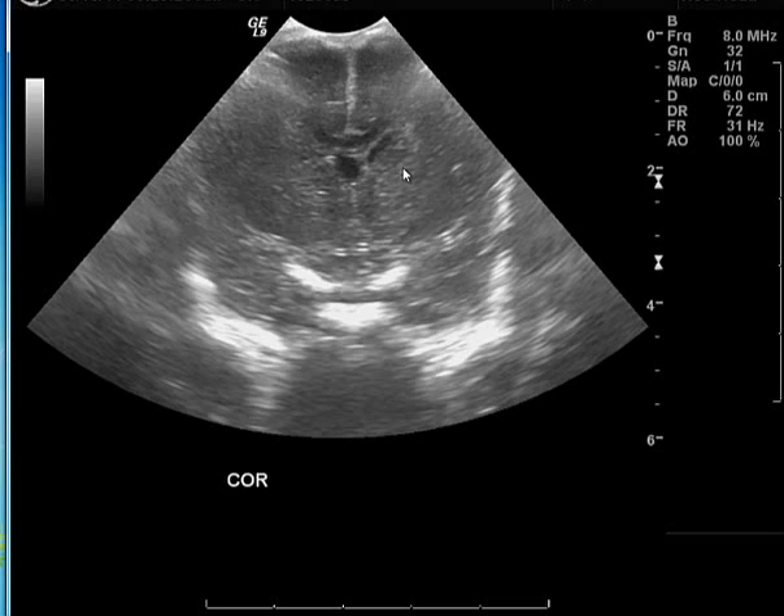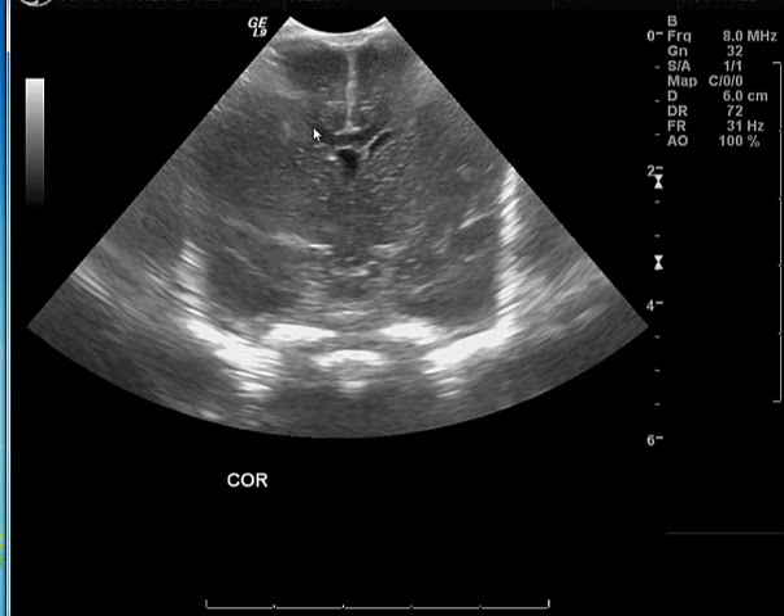Moving backwards, the next image shows the frontal horns of the lateral ventricles just coming up — that's the frontal horn on the left side. The right side is not seen because it is compressed. In between you can see the normal structure known as the septum cavum pellucidum, and the temporal lobes on the right and left with the midline interhemispheric fissure. Moving further back, you start seeing a well-defined hypoechoic structure beneath the fissure — this is the corpus callosum. The right lateral ventricle is again not visualized because it is compressed.